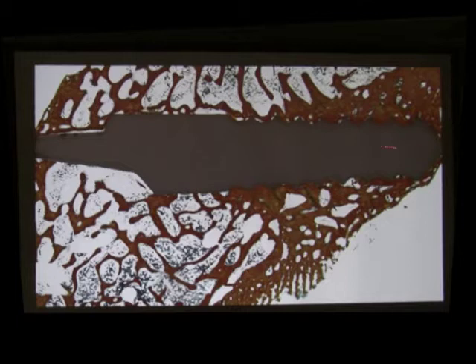We acid etch the whole implant, so not just the surface of the threaded portion, but also the transgingival portion and the abutment portion. So when we are screwing the implants, especially in flapless techniques, we do not give too much importance to whether the threaded portion is all the way into the bone or half a thread is out of the bone, because the whole implant has the same surface treatment. Many times we do immediate extractions. 75% of our treatments are immediate placement after extraction, and sometimes we can have bone contact in this area, and because of the anatomy of the ridge, maybe the bone in other areas is lower, so we are happy to have this type of surface.